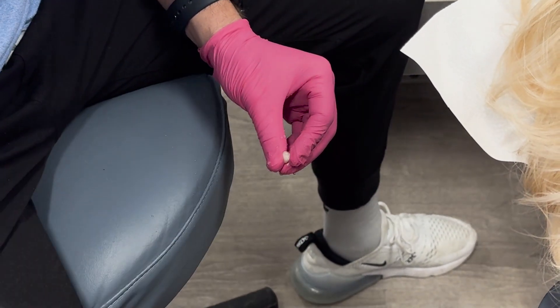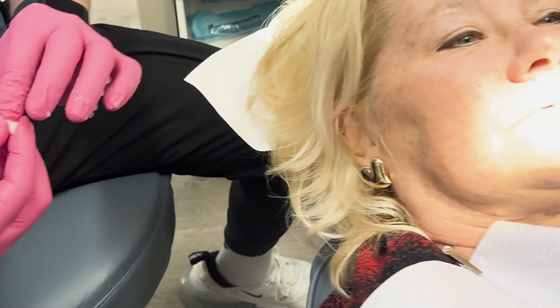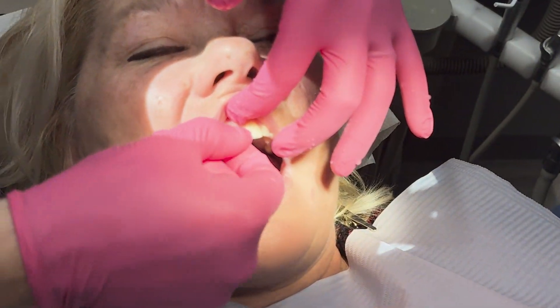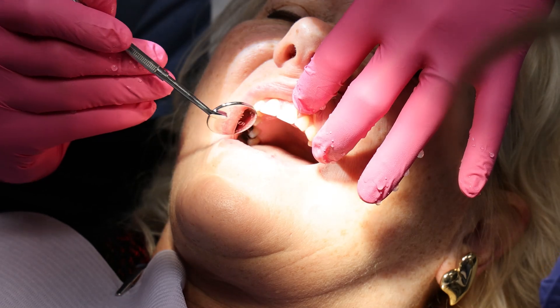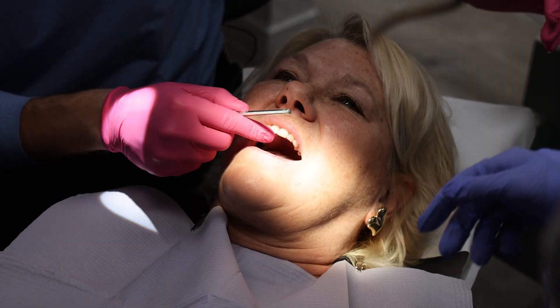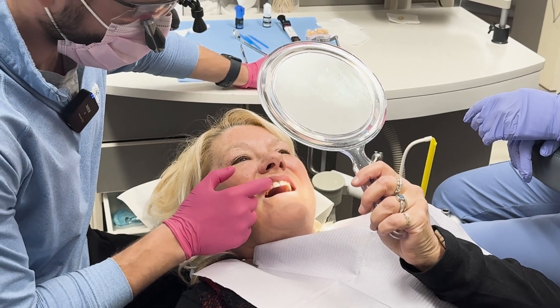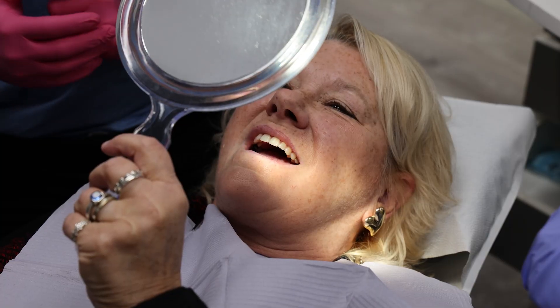Very minor things. Let's try this in again. Oh, much better - much better fit around the gums. So I want you to take a look at these. I know we discussed previously having the space between the two front teeth closed a little, but I didn't want to make the teeth too wide and close it all the way. So we did still leave a little bit of space between and I wanted to get your feedback before we move any further. Color? Shape?